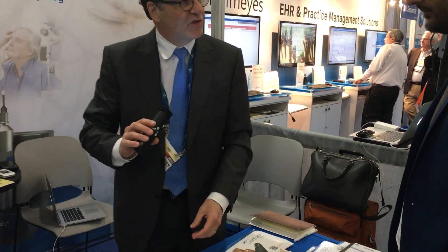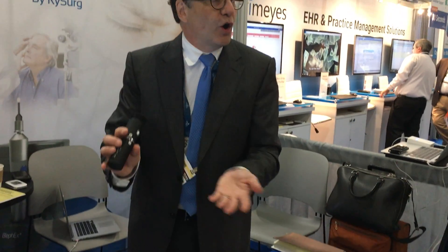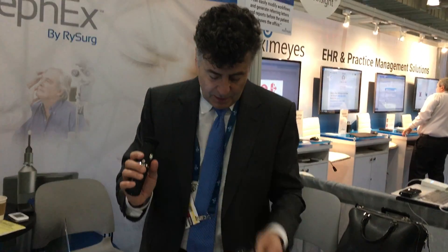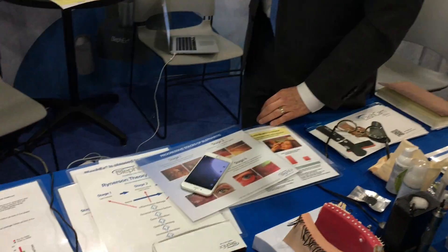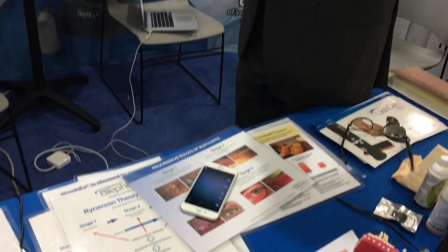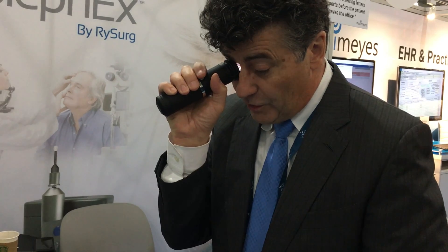I'm going to demonstrate it on myself first, then on you. If I'm demonstrating it on myself, I've got to turn it all around backwards. The big ring is the focusing knob — that's your main focus.